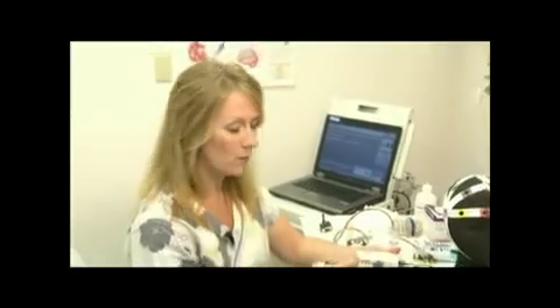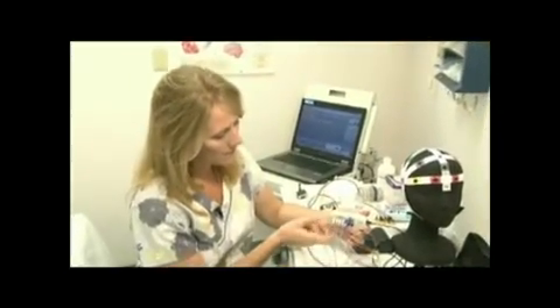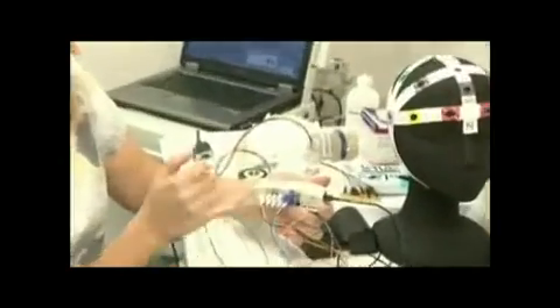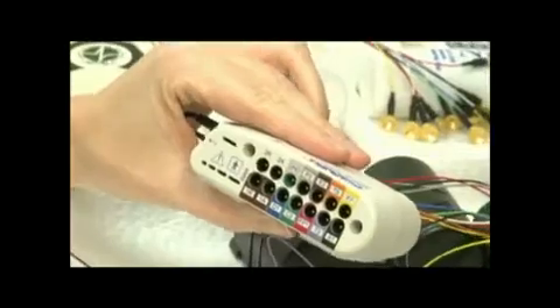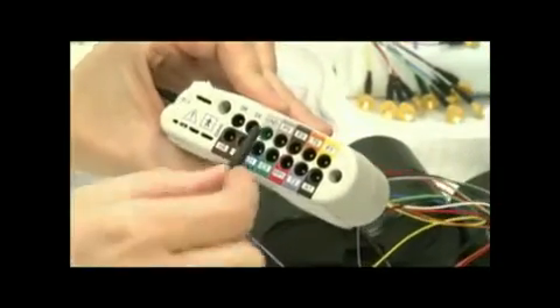Next we will set up the equipment. I've already plugged the electrodes into the right side of the Jackbox. Notice that they're color-coded and they match the color-coded markings on the Jackbox. I'm going to go ahead and plug the electrodes in on the left side of the Jackbox now.